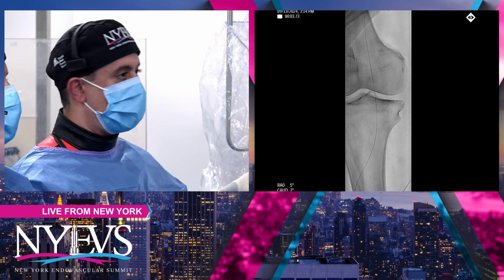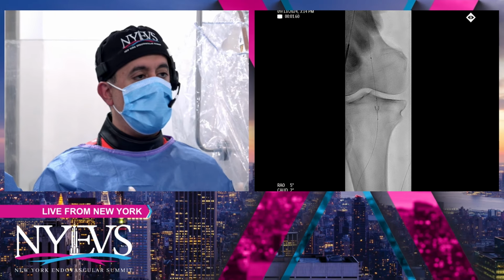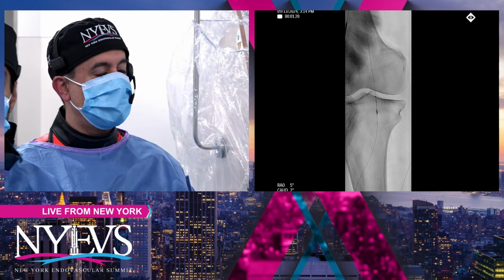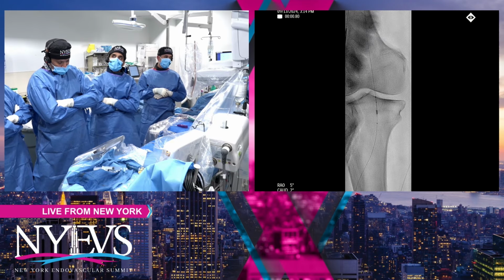From an academic standpoint, we just obviously wanted to see what's the etiology, what's the morphology, and what constituted the ISR, what was the whole significant ISR. And then we, of course, put a filter.